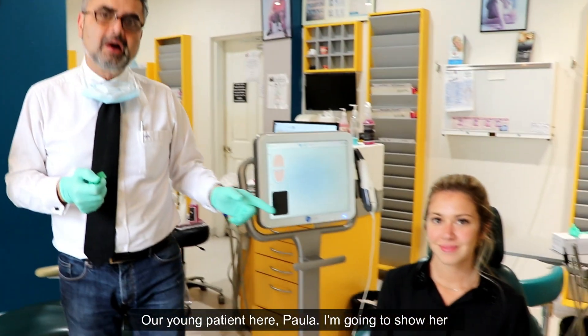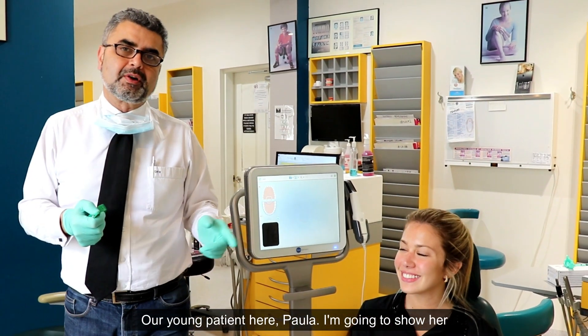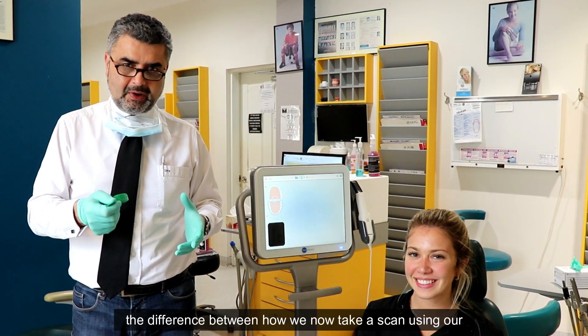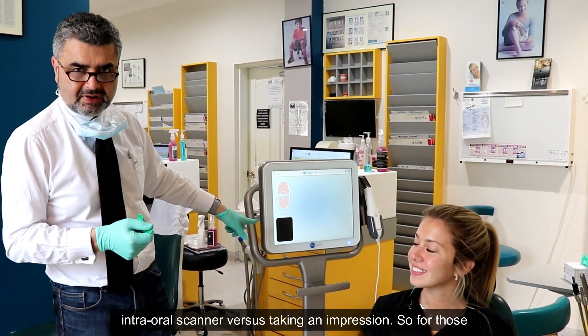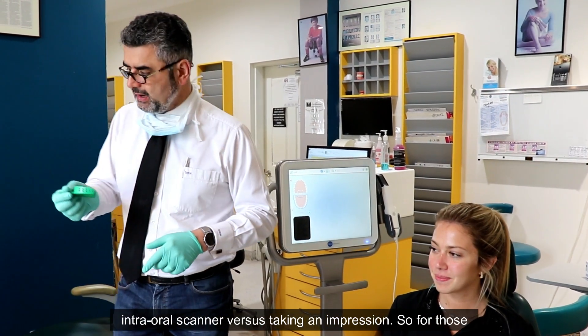My young patient here, Paula — I'm going to show her the difference between how we now take a scan using our intraoral scanner versus taking an impression.